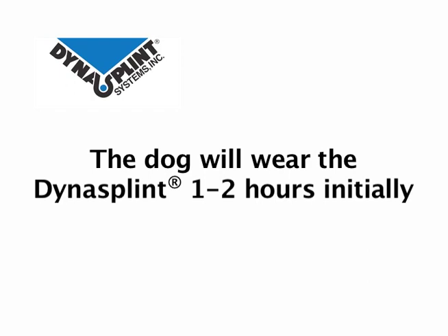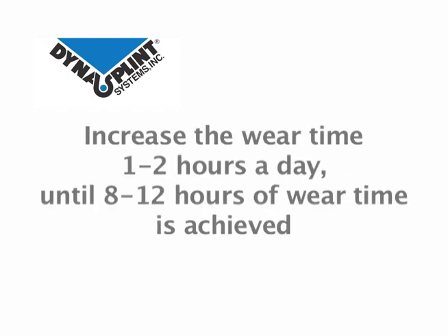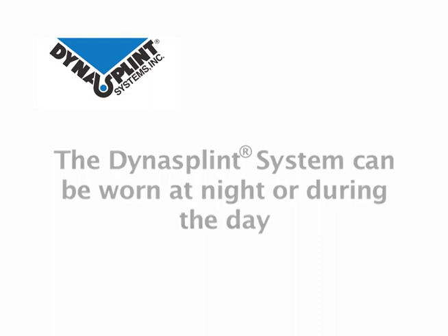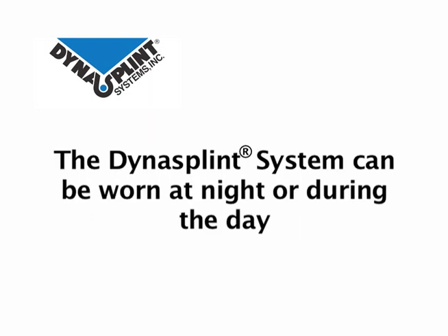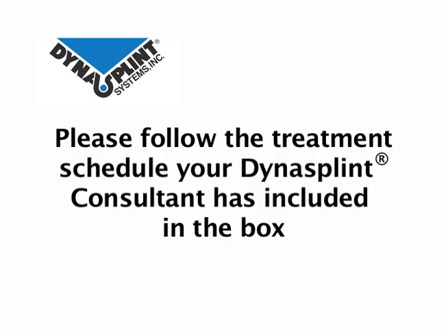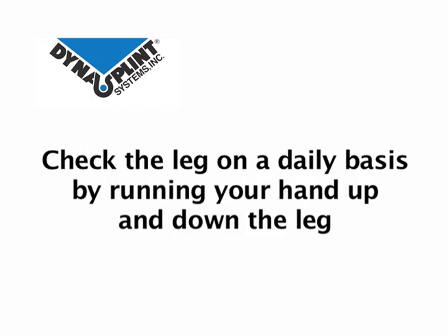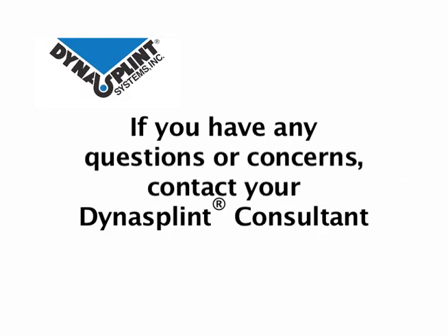The Dynasplint should be worn one to two hours initially. Wear time can be increased one to two hours daily until eight to twelve hours of wear time is achieved. The Dynasplint system can be worn at night or during the day, whatever works best for both you and your animal. Please follow the treatment schedule your Dynasplint consultant has included in the box. Upon removal of the splint, check the leg for any signs of irritation or swelling. If your dog experiences soreness or stiffness for longer than 15 to 20 minutes, please contact your Dynasplint consultant.